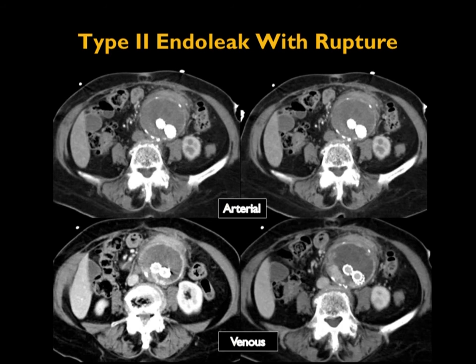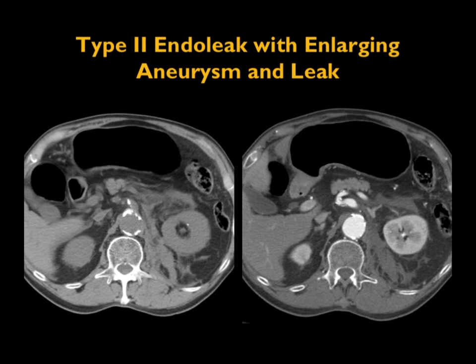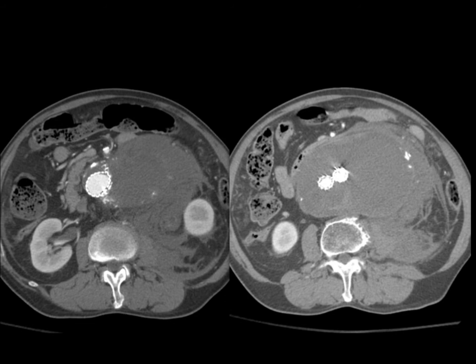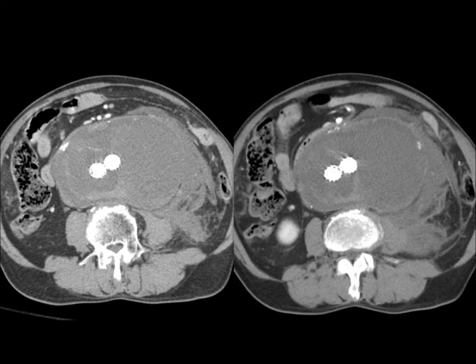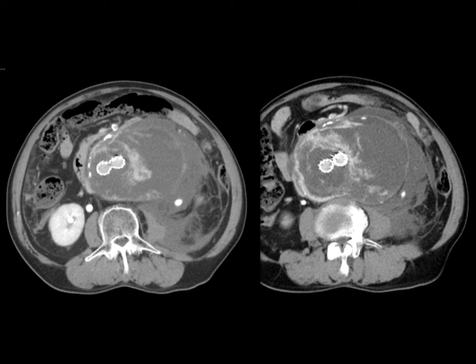Type two endoleaks can lead to rupture. You can see the vessel getting larger and the patient having a rupture. Another example shows the aneurysm increasing in size with high density in the retroperitoneum on the left and displacement of the kidney. There is an active type two endoleak with bleeding by the left psoas muscle, nicely shown on the later phase images. More than half of type two endoleaks will resolve on their own, but others will continue to enlarge the aorta and can lead to aortic rupture with active contrast extravasation.